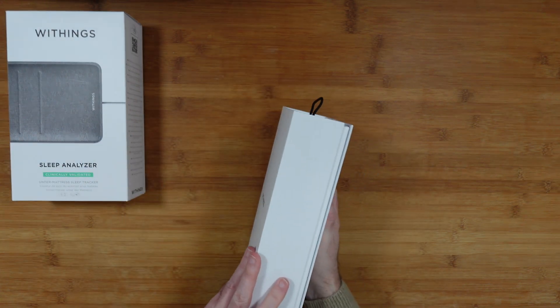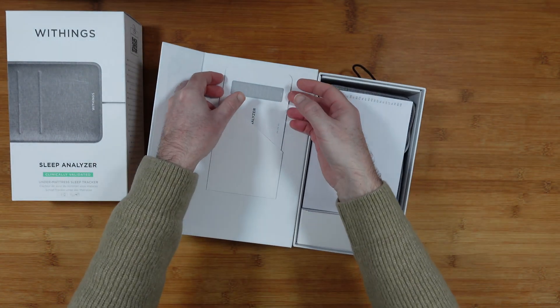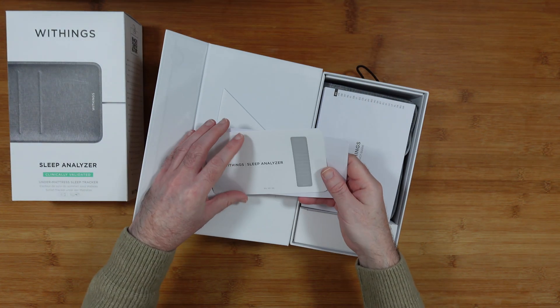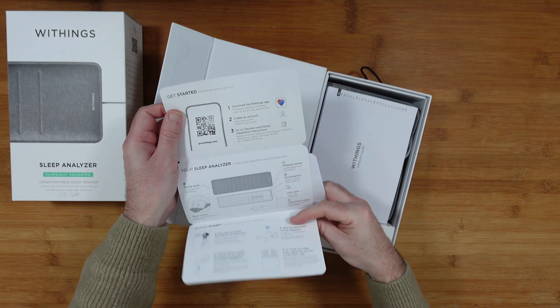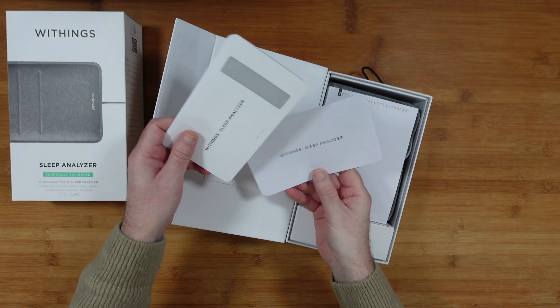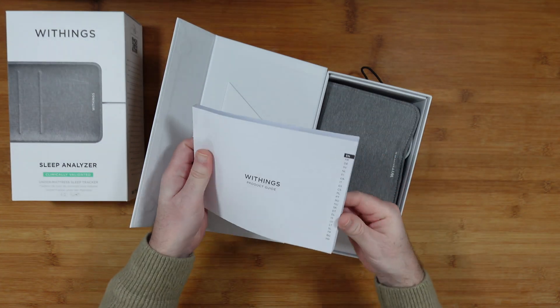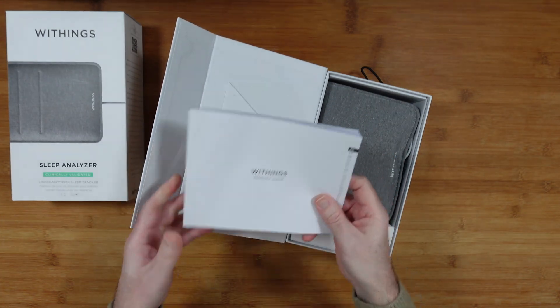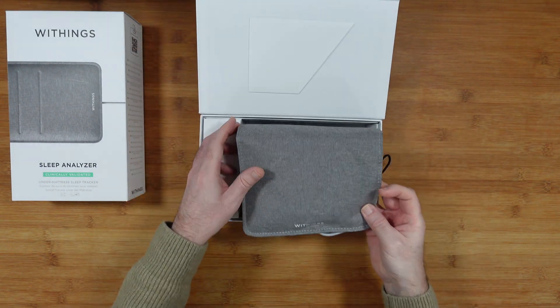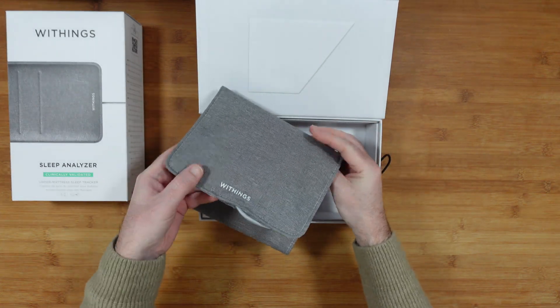This is what the inner box looks like once you've removed the outer sleeve. Inside we have a quick start guide in English, French, and German, covering app installation, how to install the sleep analyzer, and regulatory information. We've also got a full product guide — well worth reading through.